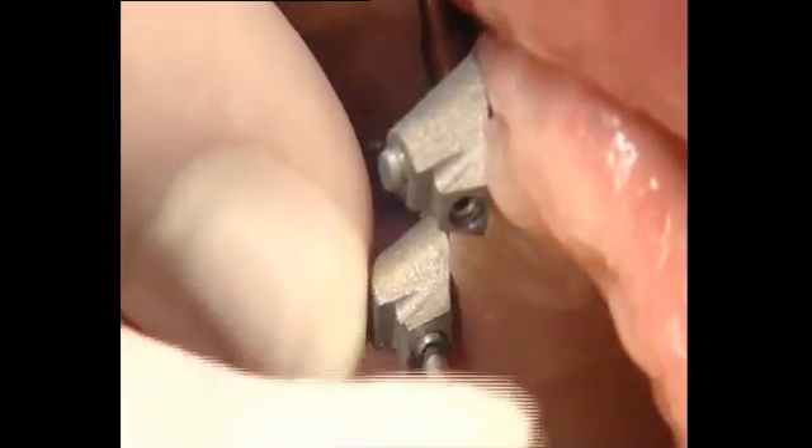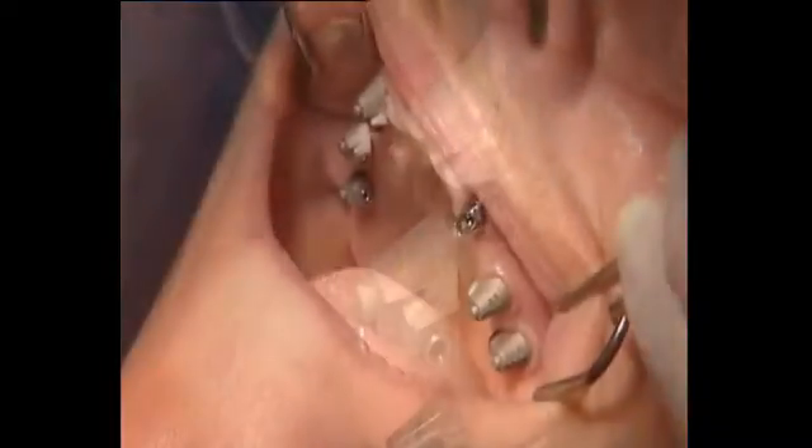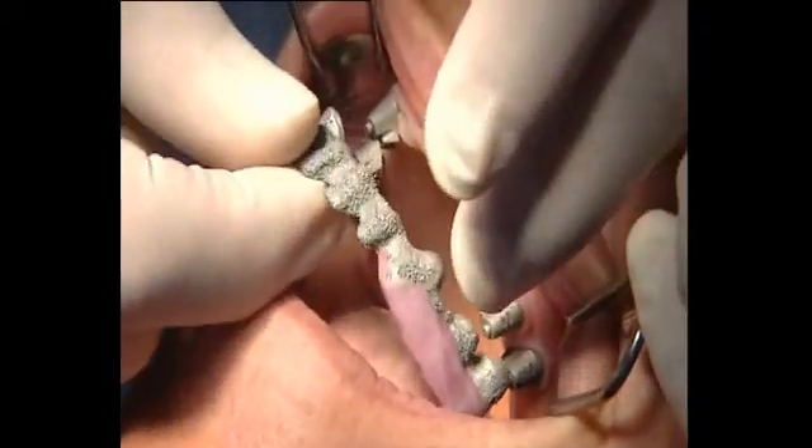The framework is first bonded with one UV-E abutment on the model to ensure the correct position is obtained intraorally. The titanium copings are screwed onto the UV-E abutments intraorally. When fitting the framework, the bonded titanium copings reliably guide the framework into the correct position.